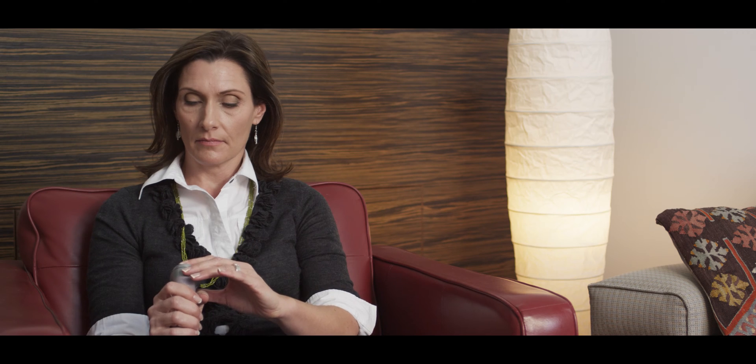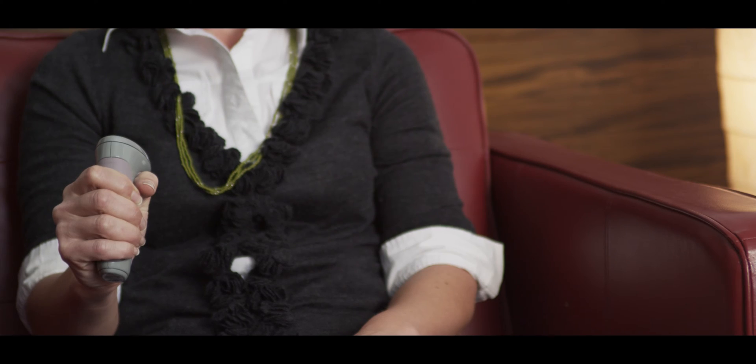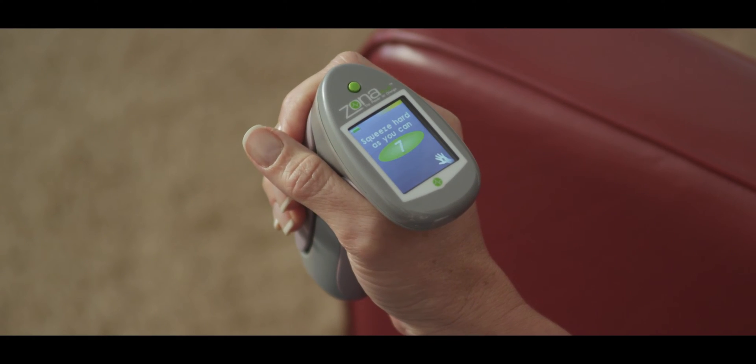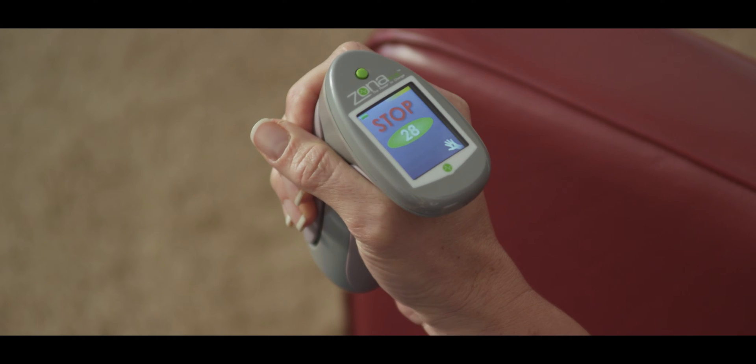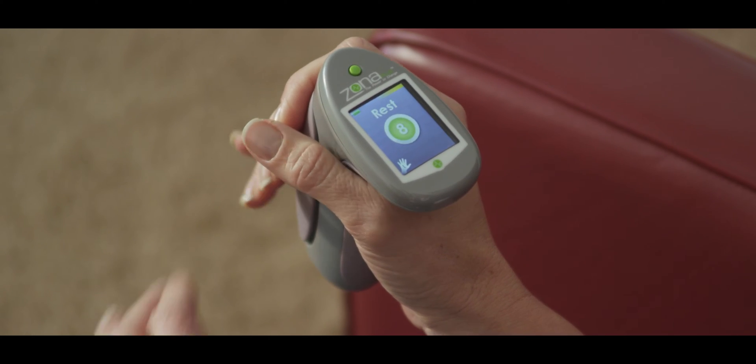Turn on your Zona Plus device. After the initial welcome screen and the user selection, each session is calibrated to your strength. Starting with your right hand, squeeze as hard as you can for two seconds. After a brief pause, repeat with your left hand.